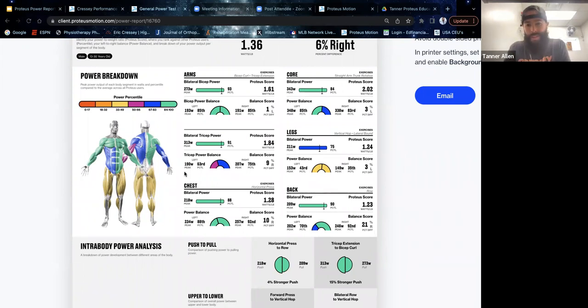So how would we even look at this from the training perspective? Like we kind of talked about previously, you want to look at your percentile rankings. You get a quick color percentile. This is comparing me against 13 to 30-year-olds that have completed this test at the same 12-pound resistance, which is what the test is set at for all these movements. We're in the process of developing some more tests that break it down into various ranges, so you could compare it specifically within different weight ranges.